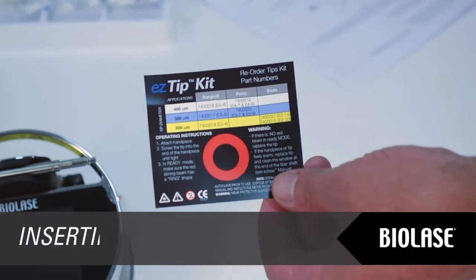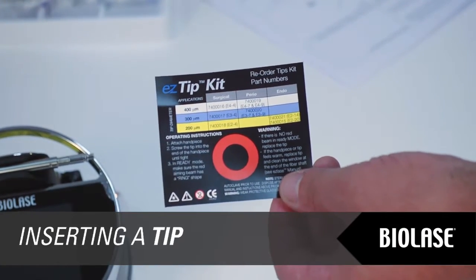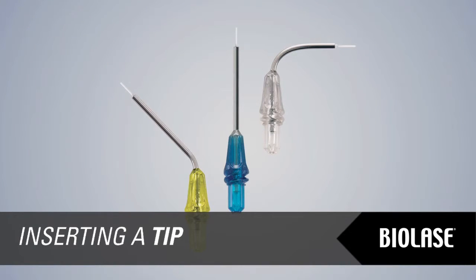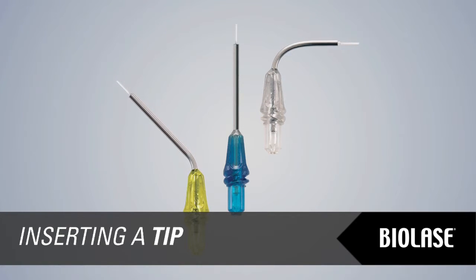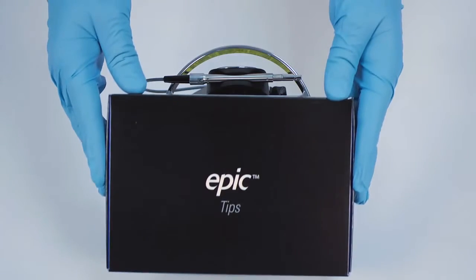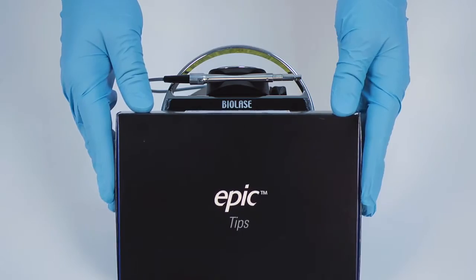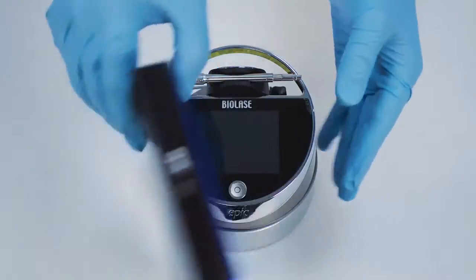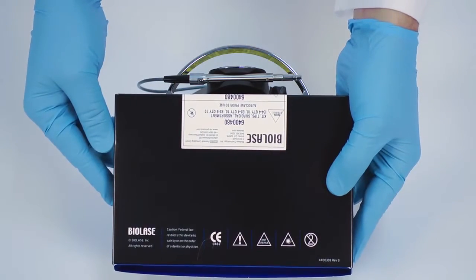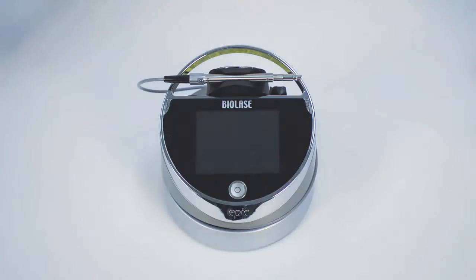Non-sterile tips for the EPIC are available in 3 diameters: 200, 300, and 400 microns for applications in endodontics, periodontics, and general soft tissue surgeries. Refer to your EPIC tips packaging for special clinical applications. The tips supplied for the EPIC are not sterile, and the packaging is not suitable for autoclaving. You should sterilize your tips in an autoclave prior to use. You will find recommended cleaning and sterilization specifications in the user manual.